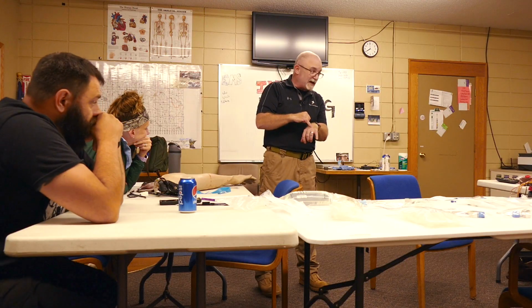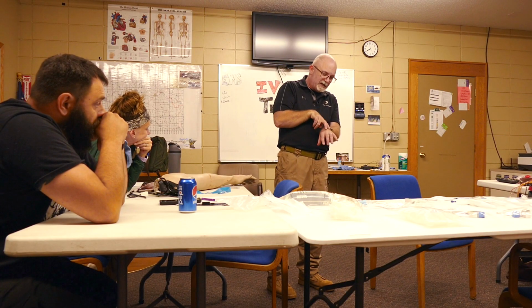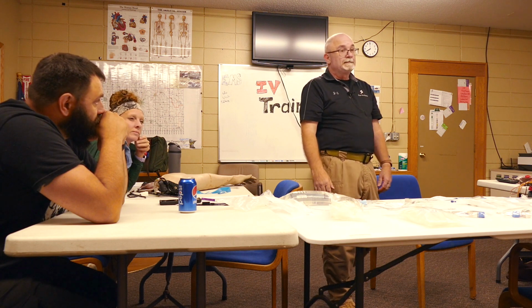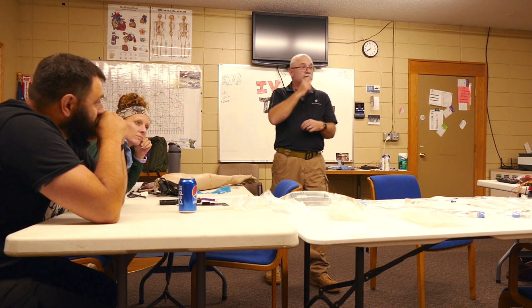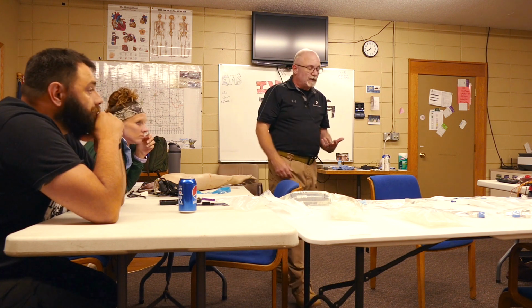That's part of why I like this one, he has a great example up here. You almost have a trifurcation there, but I kind of go up in between, go up the Y, and it doesn't move on me once I get through. It's just a wall there. So in any case, that's just me. It's one of the ones I've done.